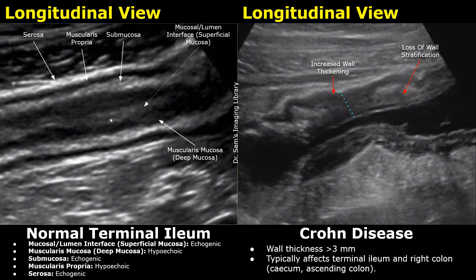Now we will compare the normal images of the bowel with bowel affected by Crohn's disease. This is the normal terminal ileum in the longitudinal plane. We can see five distinct layers. The innermost layer is echogenic and called the superficial mucosa, also called the mucosal and lumen interface. The second layer is hypoechoic and called the deep mucosa or muscularis mucosa. The third layer is the echogenic submucosa. The fourth layer is hypoechoic and called the muscularis propria. The final layer is the outermost echogenic serosa.